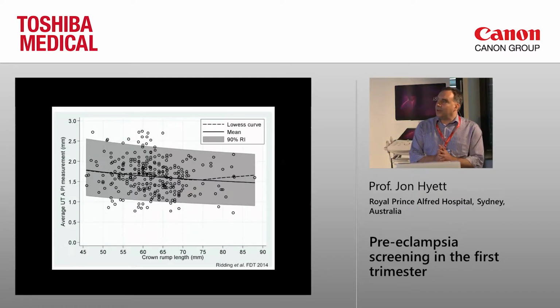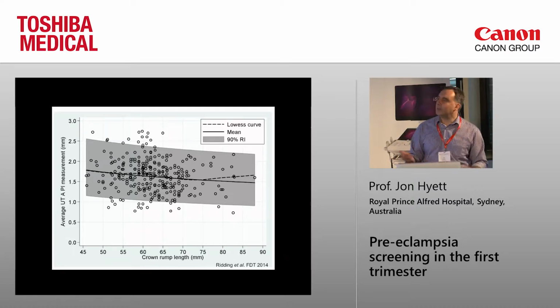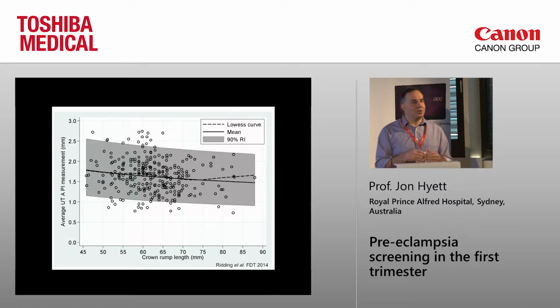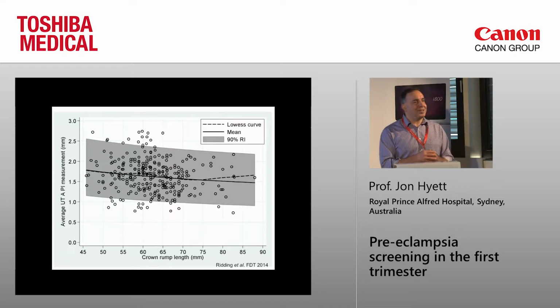So people often ask me, what's the normal range for a uterine artery Doppler in the first trimester? And if you go to the literature, it's actually very difficult to tease that out. So for example, Kypros's group, a guy called Walter Plasencia, produced a paper about what uterine artery measurements should be in the first trimester, but it's a customized measurement. So it relies on ethnicity, your parity, whether you smoke or not, what your BMI is. And if you asked Walter what's a normal value, he'd say, well, you've got to tell me those 4 things before I can tell you what the normal range should be for that patient.